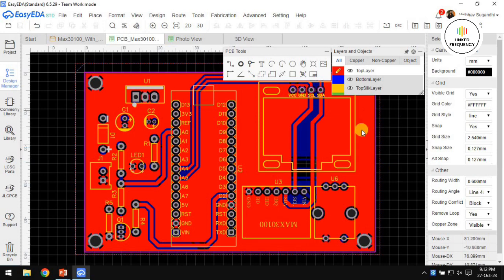We arranged it in such a way that it looks like a project and is very suitable for PCB designing and IPC standards. We have placed all these components as per the requirement. Now you can see that we have an OLED here and all these components are here. With this kind of configuration and this kind of circuit complexity, it is not possible to complete the routing with a single layer of copper. That's why we have utilized the top layer copper as well.